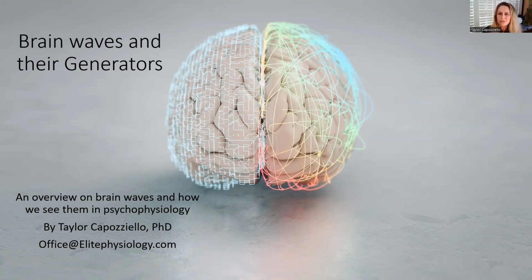We're not going to be able to go over each one in each example, but we want to provide a reference sheet to see how members of our community may use these rhythms and linking symptoms with the EEG. In our field, we look at the phenotype and train that, not the diagnosis. Many diagnoses will have crossovers in the EEG pattern, so although it is helpful to connect the dots, ultimately the important part is looking at what we expect to see in the EEG and what we actually see, and helping that person reach their goals to attain that.